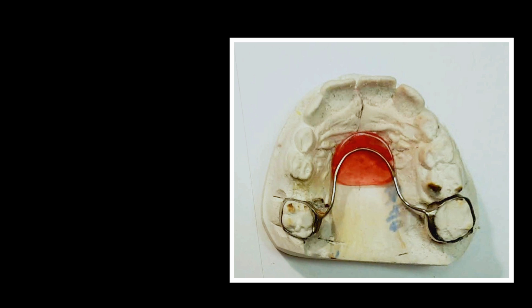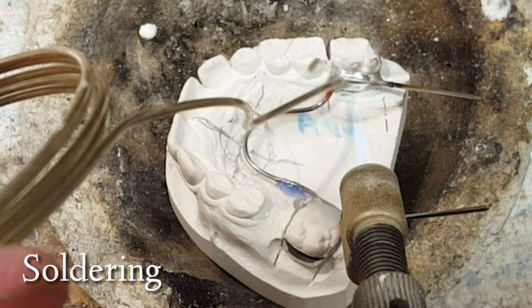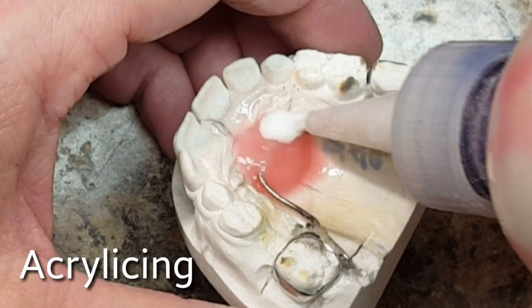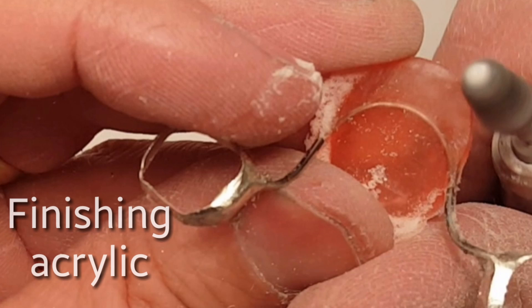The first thing you're going to need to be able to do is bend 040 wire. The next step, you have to be a good solderer. Then you will add acrylic to create the Nance button, and of course you have to know how to finish metalwork and also to finish acrylic work.